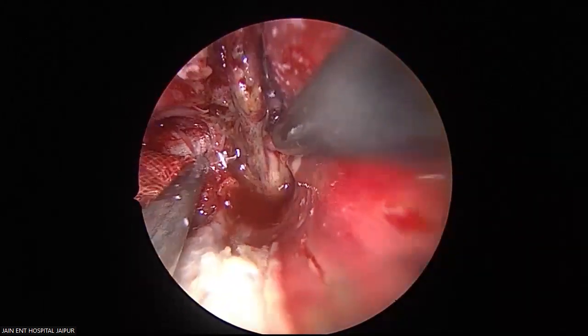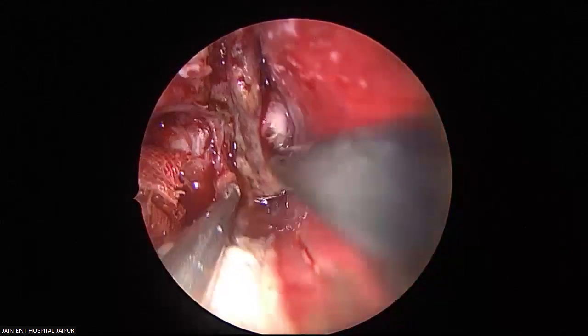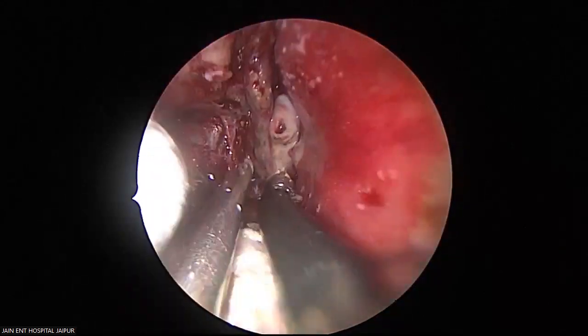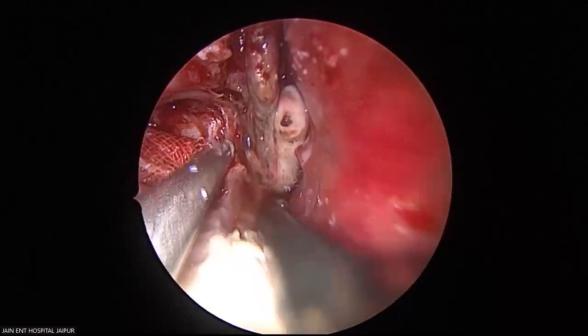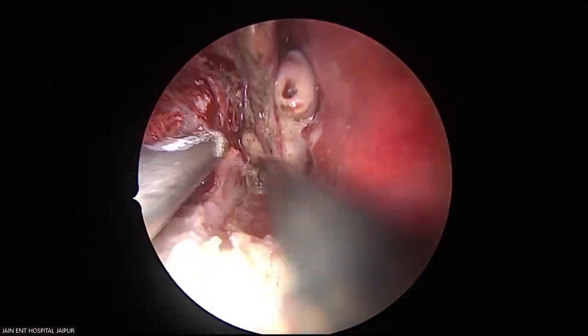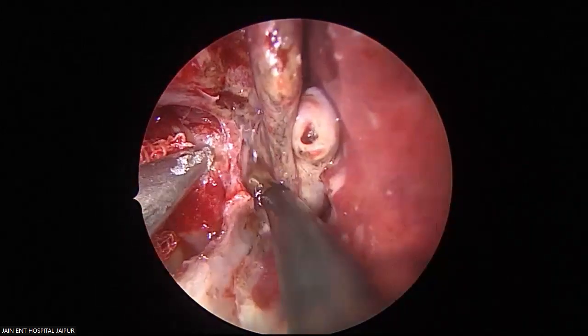See this tumor surface? See the tumor surface, I am coagulating. That's a part of the inferior turbinate. See, it has shrunken the tumor as well, along with devascularization on the surface.